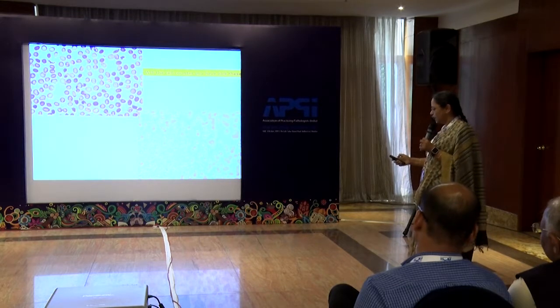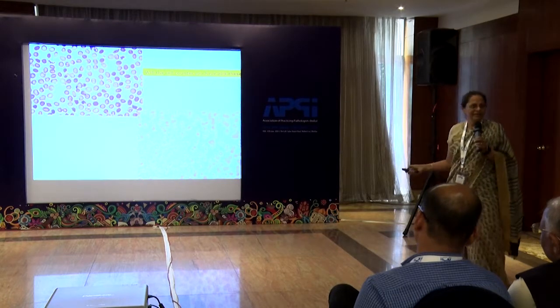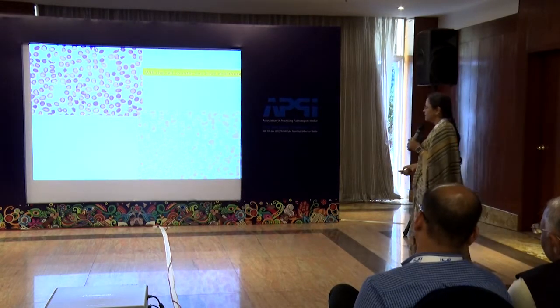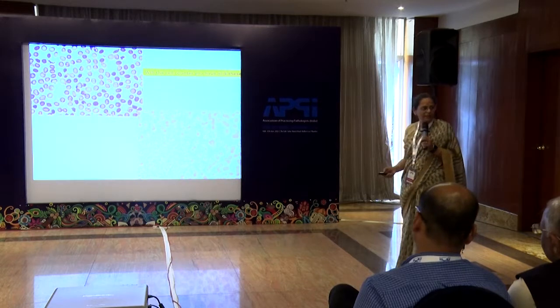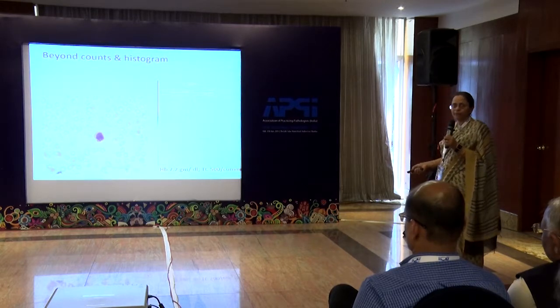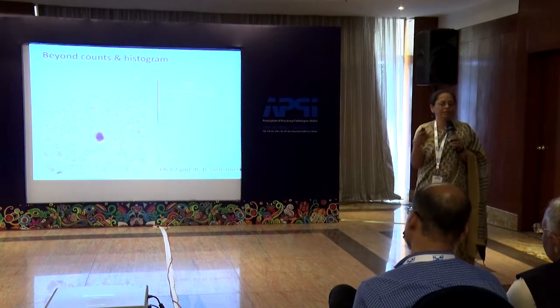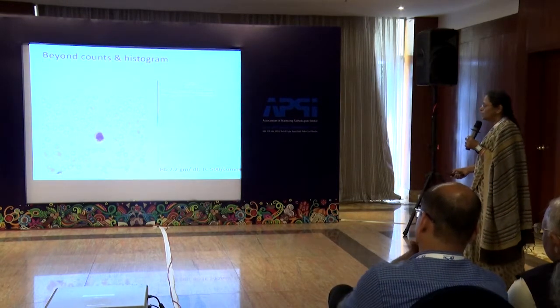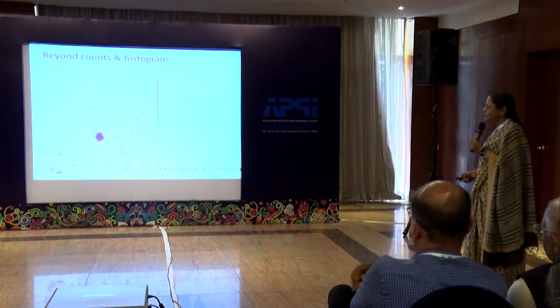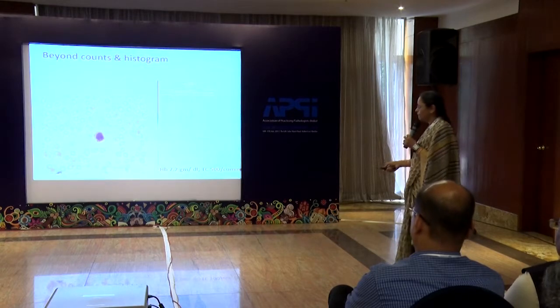So your instrument, I don't think, is going to pick up the difference between these and this, although it may flag. Unless you look at the microscope, you will miss these kinds of diagnoses. So beyond looking at the histogram, when you look at individual cells, you can point in which direction the patient should be evaluated. You see one cell like this with a leukopenia, 500 is the WBC count, and this at least raises the antennae for what?